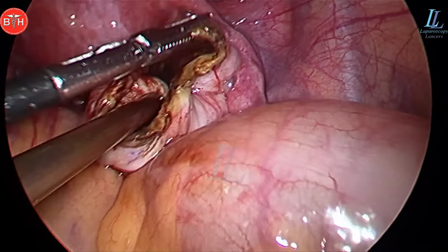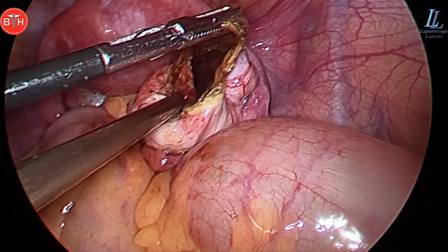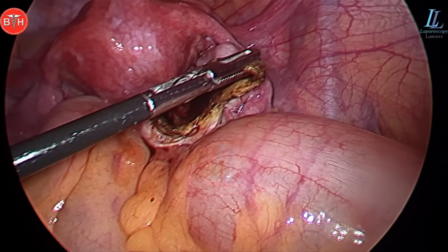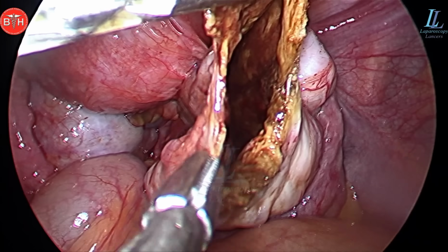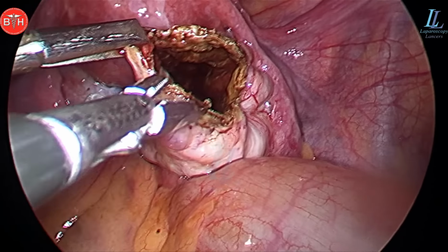And now, as the plan is to save the ovary, I'll have to take out the cyst. So how do we take out the cyst? Obviously we'll be stripping the cyst apart from the ovarian tissue that is lying outside. So I'll be using a Maryland grasper, slow and steady, step by step. Nothing great in the surgery.